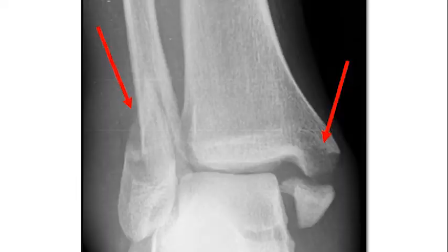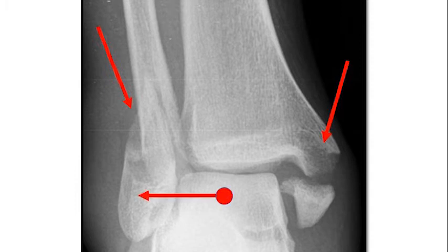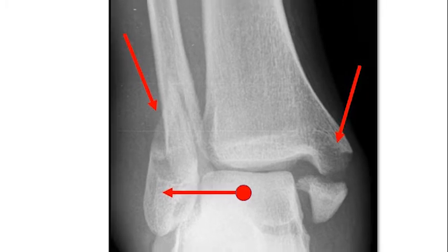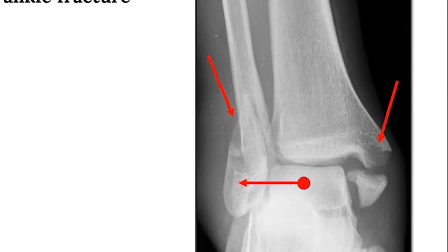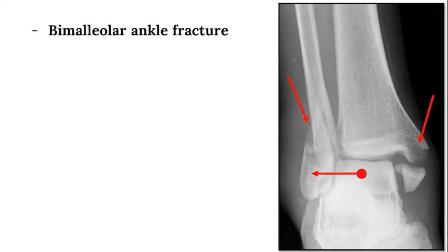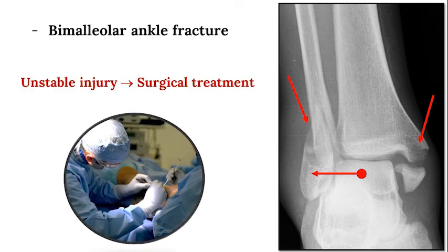This is an example of a bimalleolar ankle fracture, with the x-ray demonstrating fracture of the lateral malleolus and the medial malleolus, and there is a corresponding subluxation of the talus within the plafond. Given the fact that the lateral malleolus is fractured in the setting of a fracture of the medial malleolus, this is an unstable injury and requires surgery.